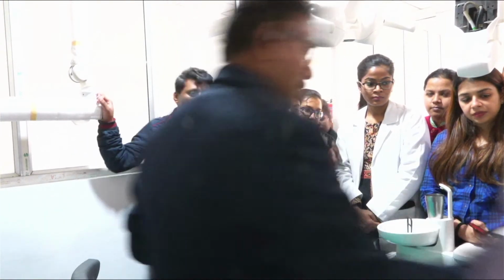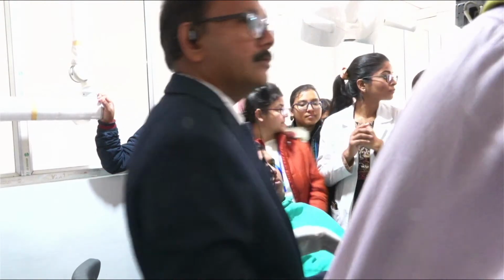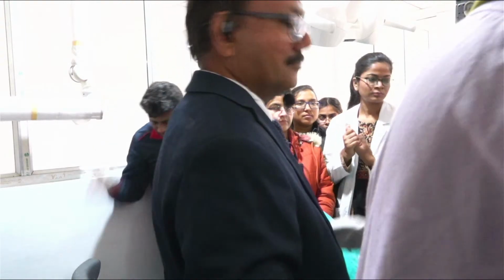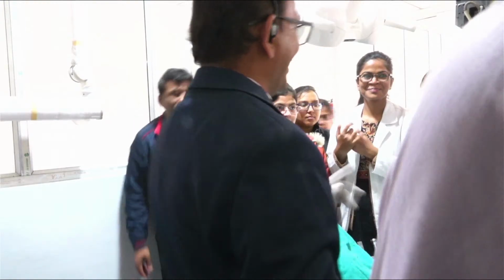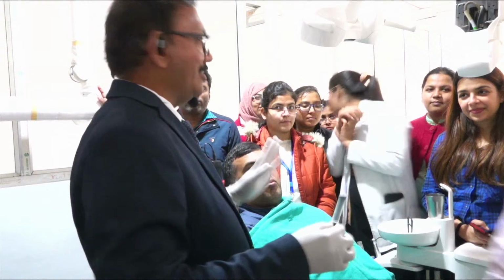Cotton is not kept today. Pen wala. You will be handicapped there. You can't cut the tissues if you are using that pen.